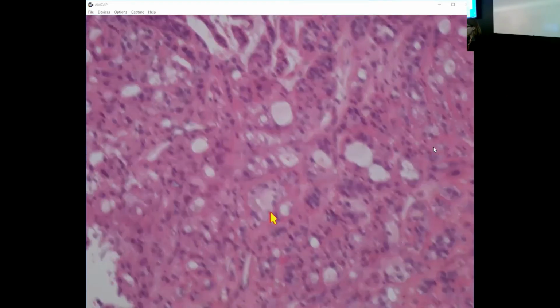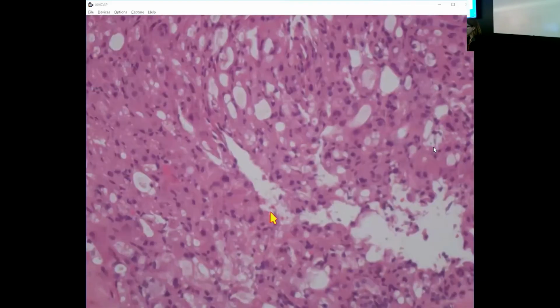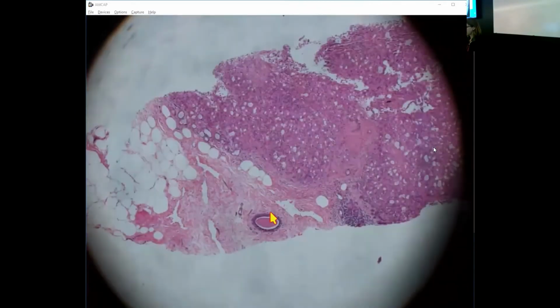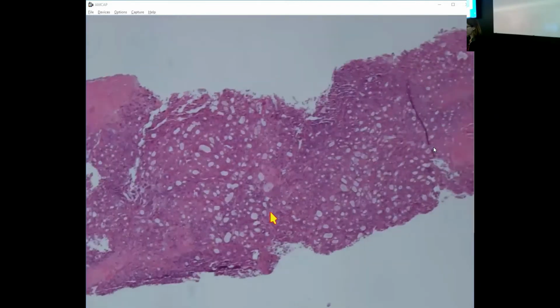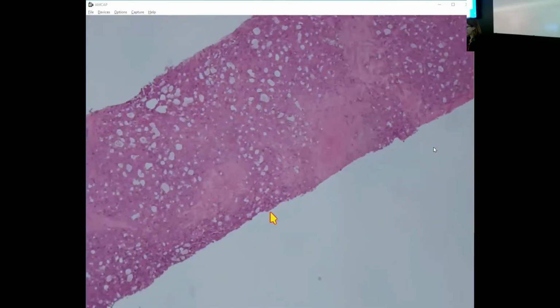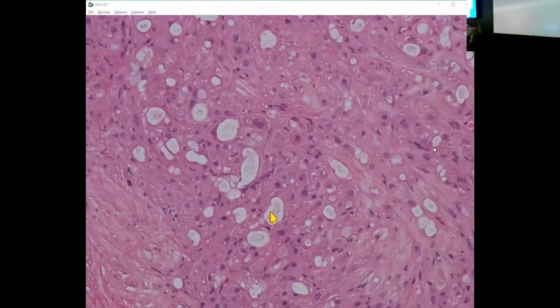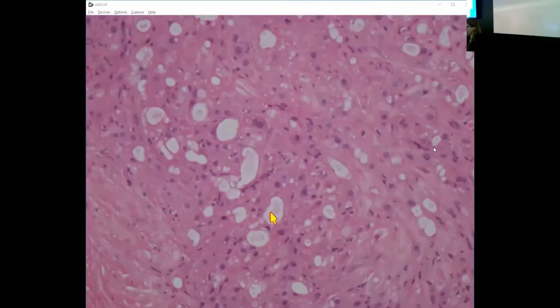She had an excision, and I think there was not much else. So there you have it. But that was something that I hadn't considered as a differential diagnostic thought for apocrine adenosis. But I can certainly see how that would occur to somebody. And you can see there's a little bit more cytologic atypia in this core here, I think.